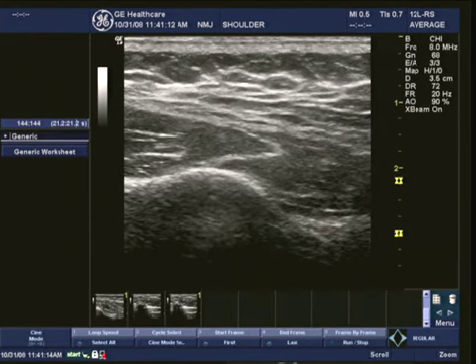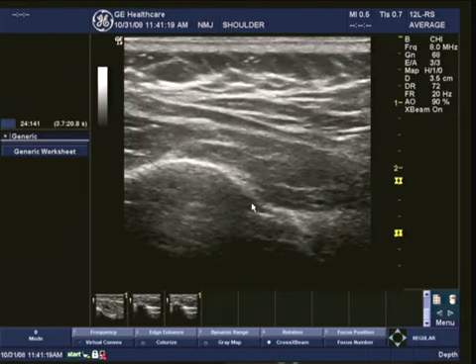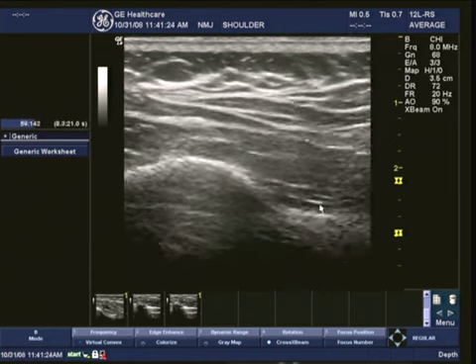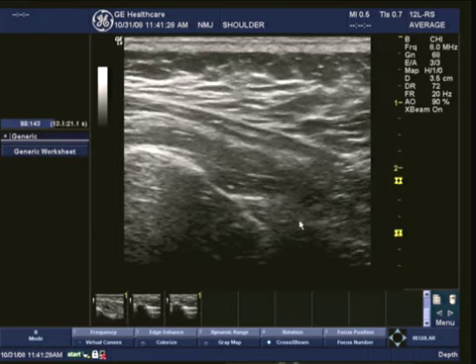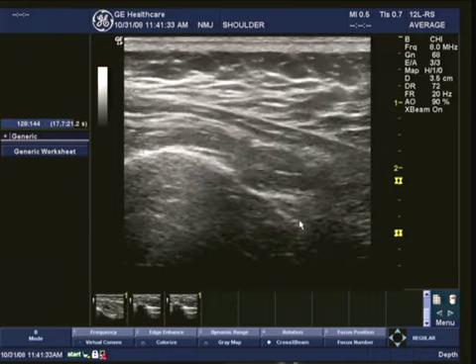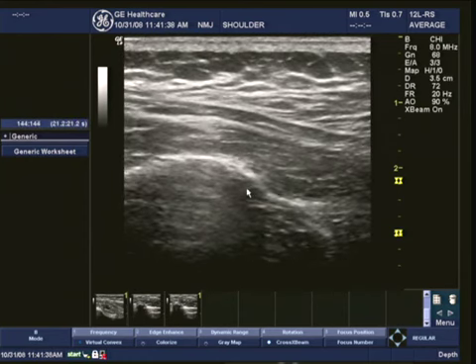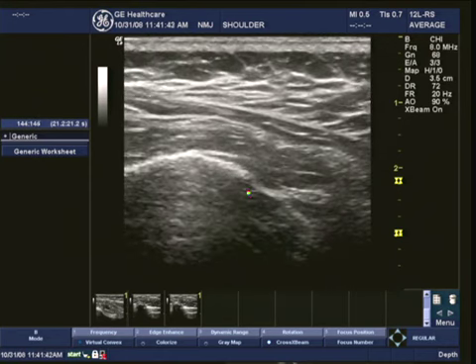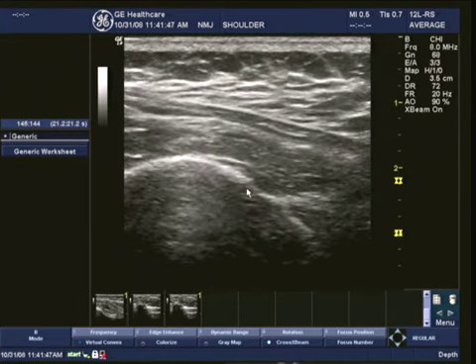So with her, we can begin to see portions of the humeral head, and then just to the right of that would be the area where the glenohumeral joint and that complex will be involved. It is not usually a site of much pathology unless a patient had a specific injury, such as a fall onto the shoulder. But this would be the region that you would look in. In rheumatology, I find that the anterior glenohumeral joint is more involved, particularly with things like osteoarthritis. So that concludes the glenohumeral examination.